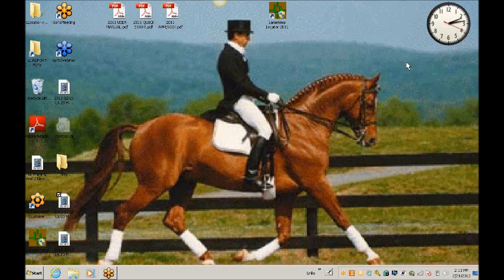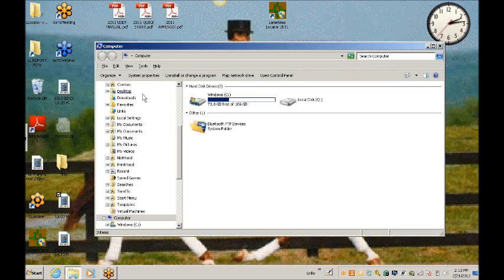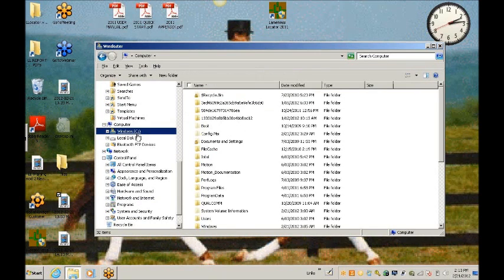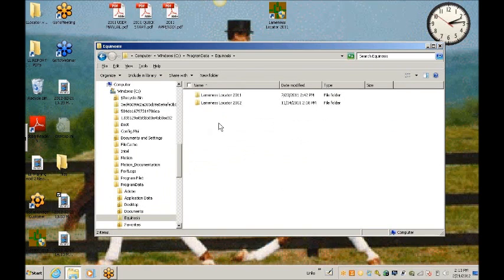To replace the Lameness Locator sensor, you must update the Bluetooth address information within the program. In order to do this, select the Start menu, navigate to Computer, scroll down, select Windows C. Over in this window, select Program Data, select Equinosis, select the Lameness Locator program.